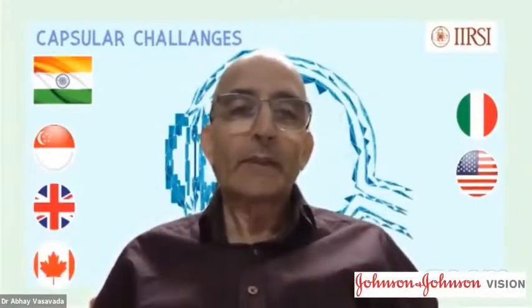So great points, Namrata, and we cannot finish this without taking a word from Dr. Vasavada, who's the master of posterior polar cataracts. Thank you. I will recognize the teaching of Dr. Osher in this entire topic, but I would suggest mechanical hydro inside out delineation. If you're not doing a femto, I would prefer femto, but mechanical inside out would reduce the chance of inadvertent subcapsular hydrodissection. But Tushar, you did a great job and beautiful cases.